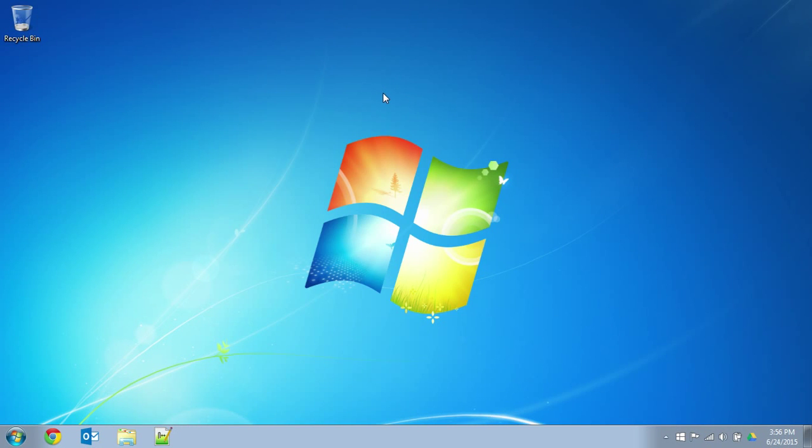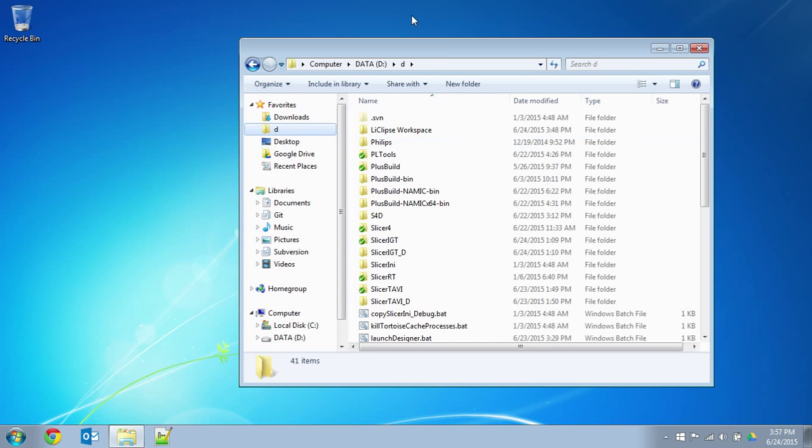I'm a PhD student at Robarts Research Institute at Western University, and I'd like to walk you through setting up a development environment for Slicer and Python using LiClipse as the development environment. So let's get started. Basically, I want to walk you through my development environment.